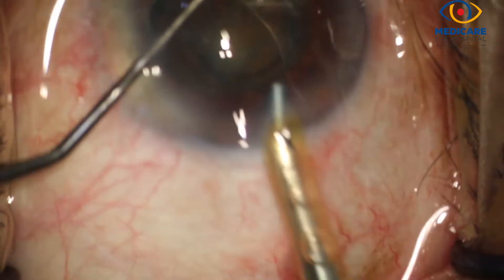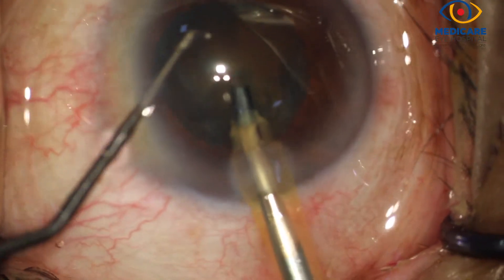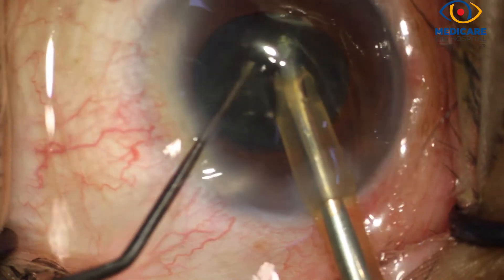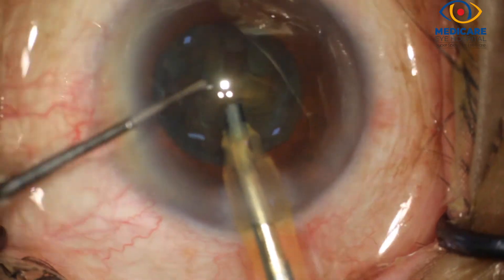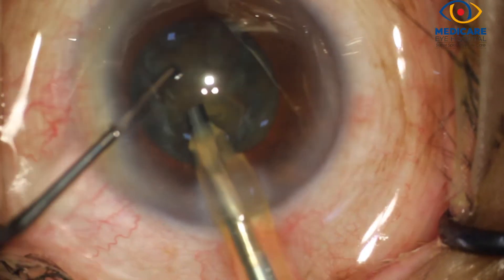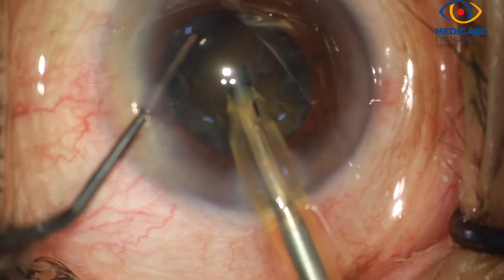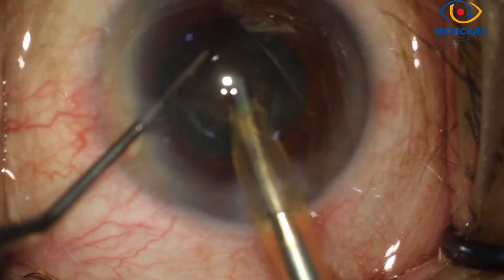Once the nuclear pole is lifted up, a ball tip phaco chopper is used to engage it and the nucleus is impaled with the phaco tip. As you can see, the nucleus is gently nudged, then cracked in two halves and rotated for disassembly into smaller fragments.